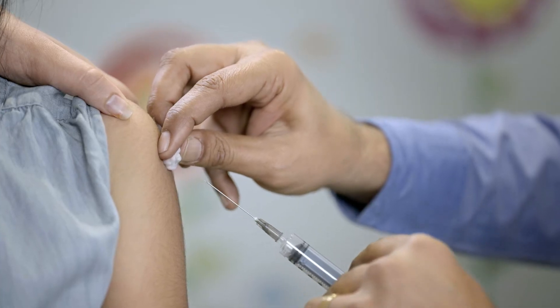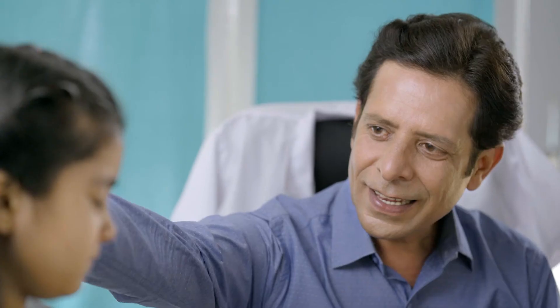Visiting a doctor is a positive experience unless the fear of a painful injection enters the room. It's done. Done? But now with the smart device ExoCool, patients can have a painless injecting experience.